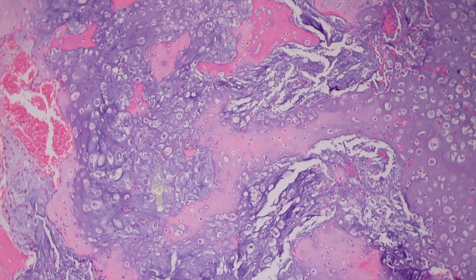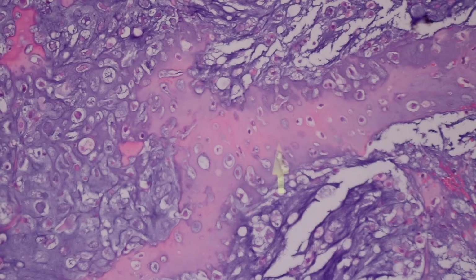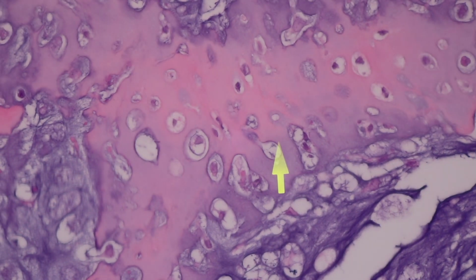And then, can I ask, that pink stuff right in the middle there, is that collagenized cartilage? I would say it's pink cartilage. I can't tell you. But it's not bone, right? It's not bone. Because that's what I've always struggled with, the pink dense areas. I don't know how to explain them. They look kind of like cartilage, but they're pink.